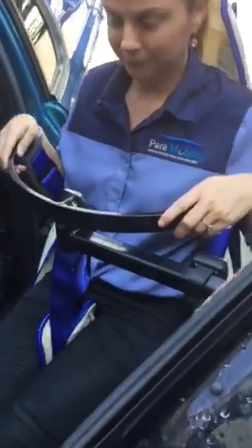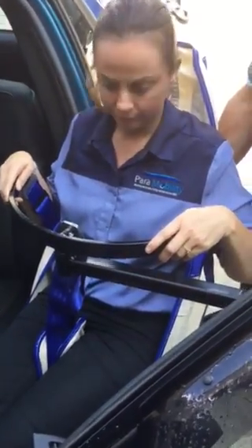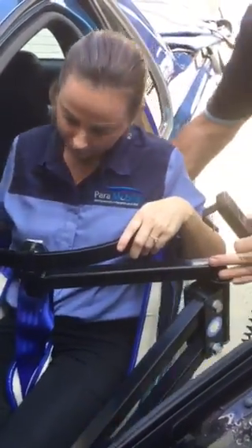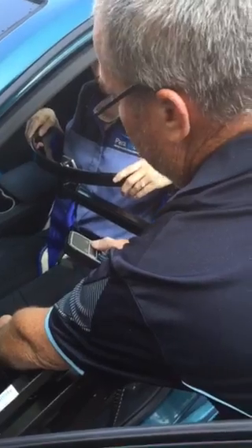In this case, I'm going to do a feet-first transfer. I've just worked out that I need to go up just a fraction higher, then swing around. Once we're in, I'm now going to push back on Tanya's knees and drop her down into position.